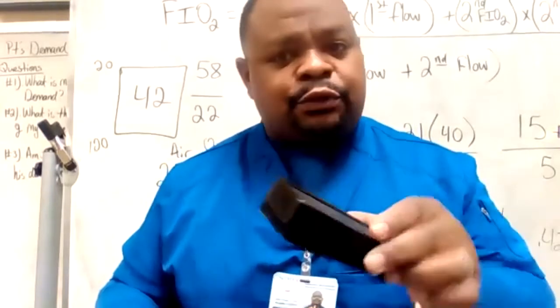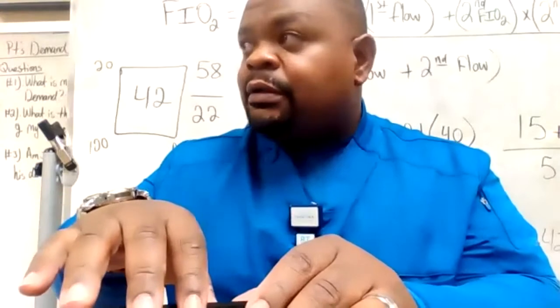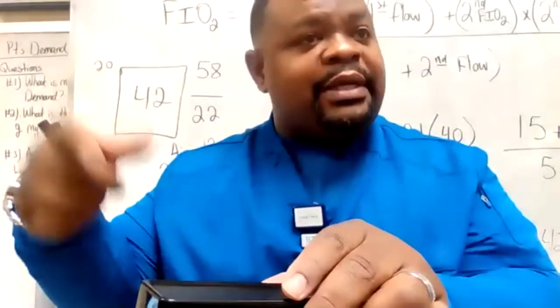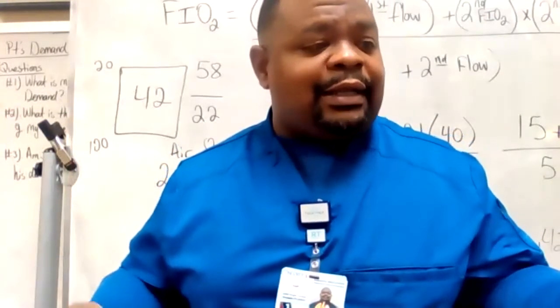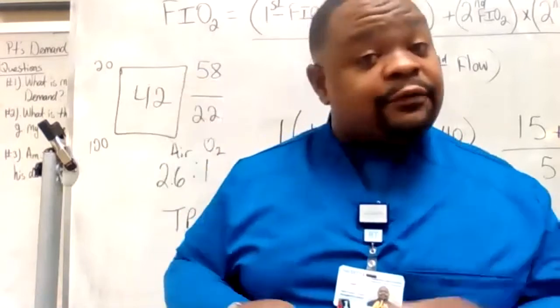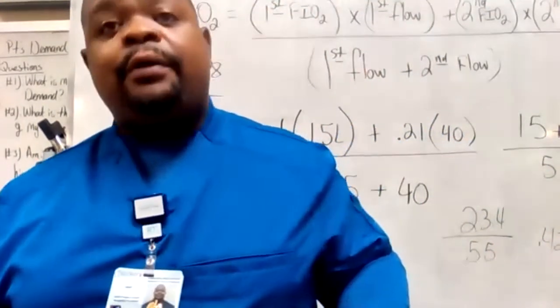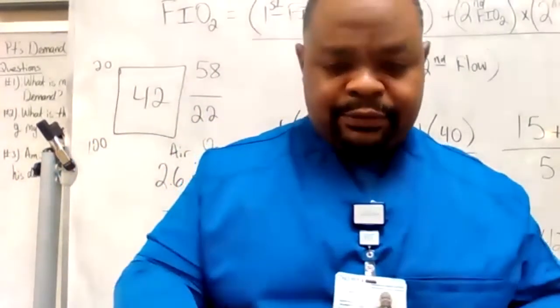Also, we have what's called an analyzer now that looks about like this. It's a little device that you put in the flow of the oxygen, and it'll give a little digital reading that says, okay, we're 30%, 40%. It'll keep going until it meets whatever it is. It will read the oxygen for you. It will analyze it for you. But it won't read the flow. Only you can tell me how much flow is actually on there. All right, now let's go on to the hyperbaric therapy.